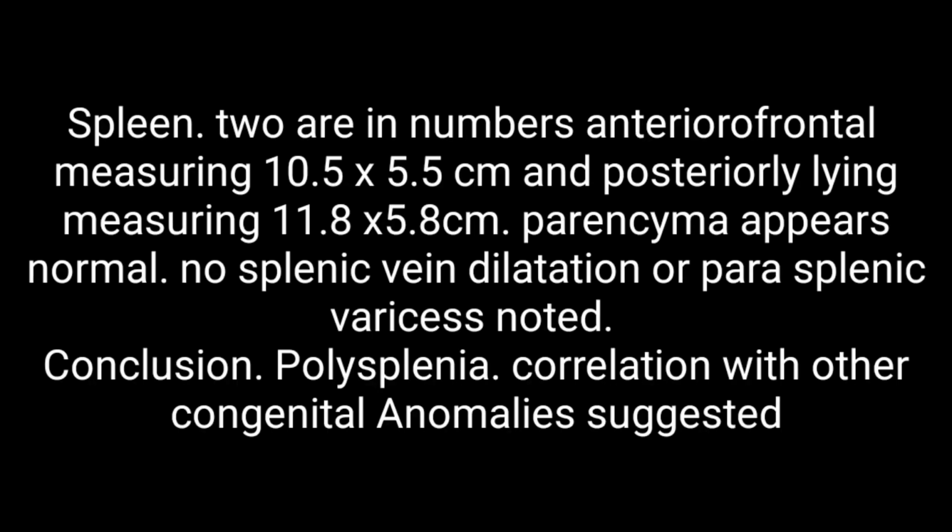Mind you that in ultrasound scanning, the most important part is the report writing. This is what displays your diagnosis in front of your colleagues, your physicians and surgeons. So you have to write the report in such a way that you can easily pass on your message, what you are going to say about it.